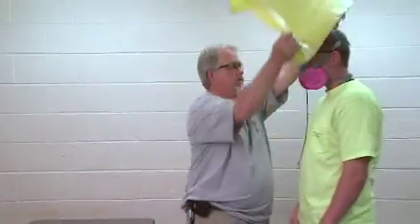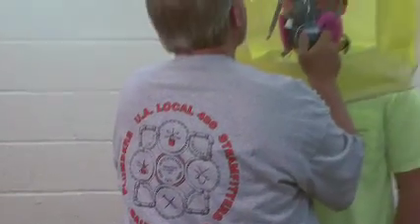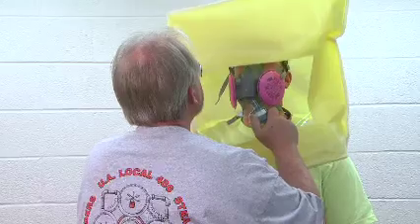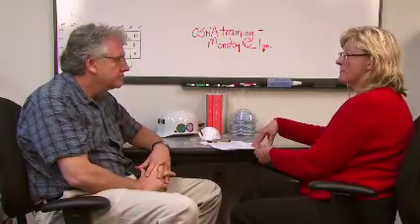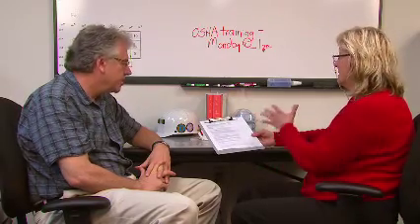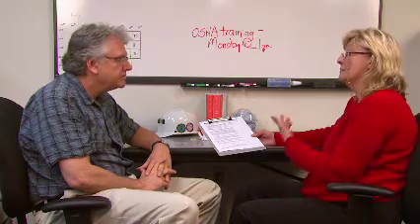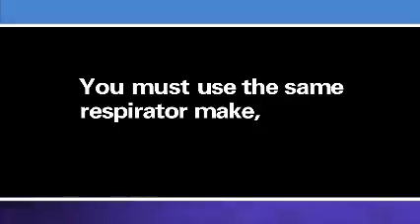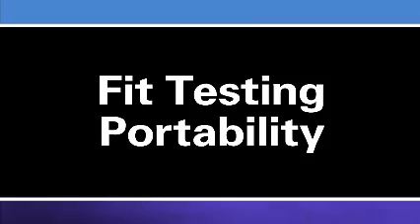Fit testing can be done by your employer or an outside party, including a union and apprenticeship program, a contractors association, or a past employer. Your current employer is permitted to accept fit testing you have received from an outside party, such as a former employer, within the last 12 months, as long as you use the same respirator make, model, style, and size at your new work site. This is known as fit testing portability.